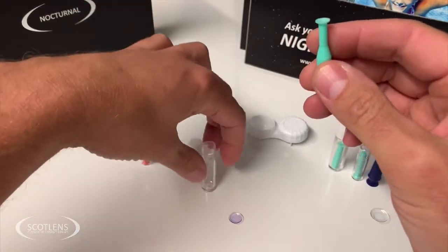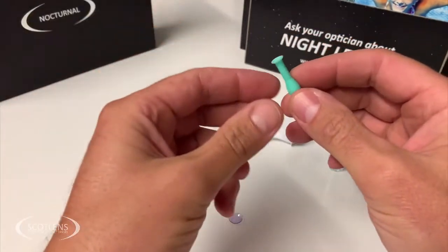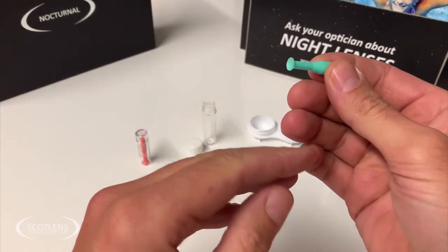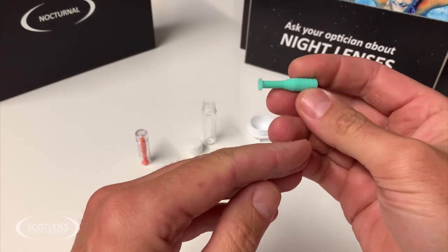Now, best use for the sucker: it is of course best for patients to be able to insert and remove lenses without the sucker — it means there's no hygiene issues and no issues if the suckers get lost.